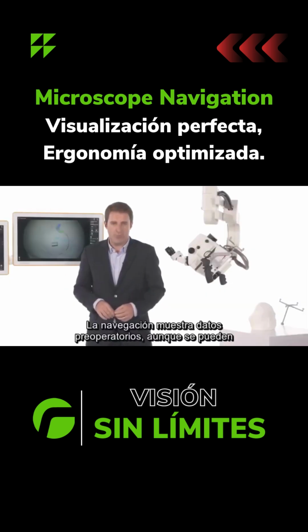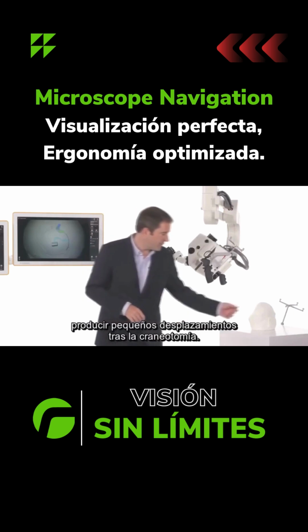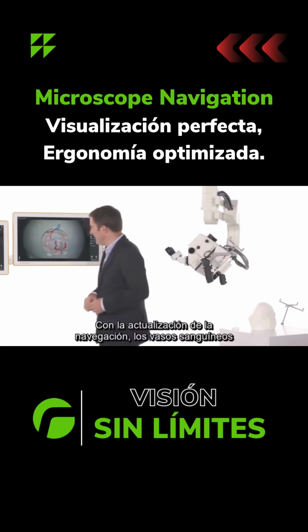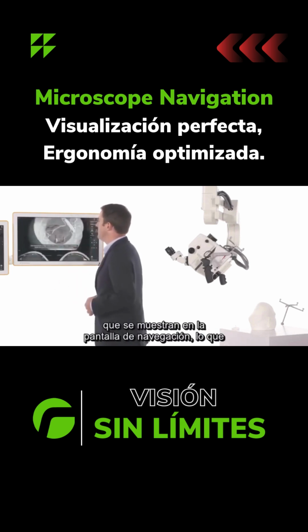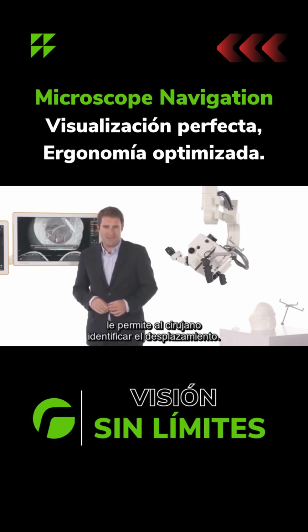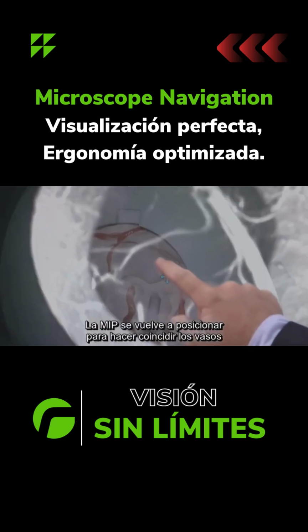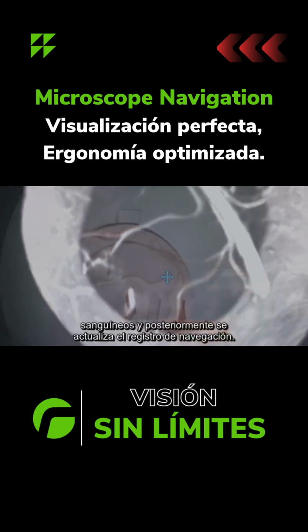Navigation shows pre-operative data. However, small shifts in anatomy may occur after craniotomy. With navigation update, vessels on the cortex can be compared with their corresponding MIP displayed on the navigation screen, enabling the surgeon to identify the shift. The MIP is then repositioned to match the vessels seen, which subsequently updates the navigation registration.